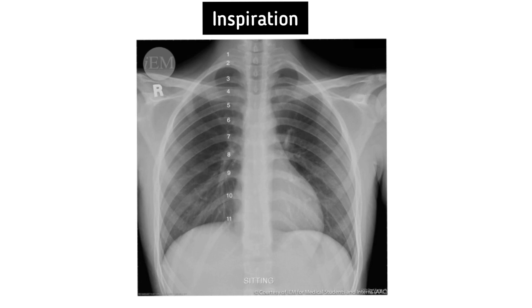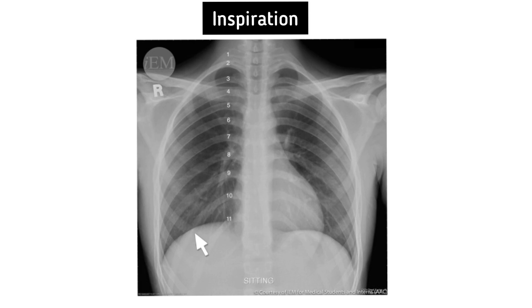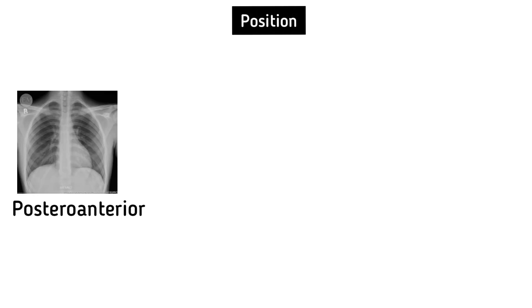Next, inspiration. To assess the degree of inspiration, it is conventional to count the ribs down to the diaphragm. The diaphragm should be intersected by the fifth to seventh anterior ribs in the mid-clavicular line. Fewer ribs visible is a sign of incomplete inspiration.